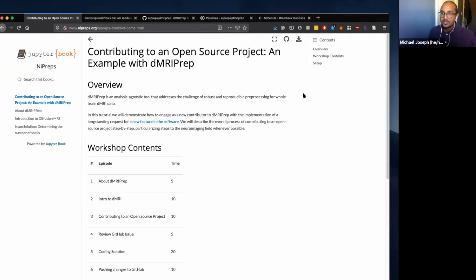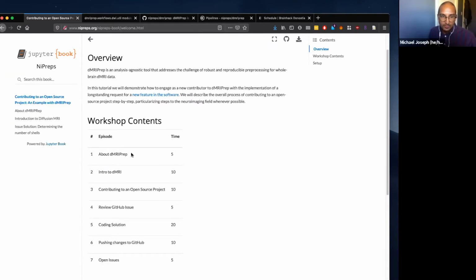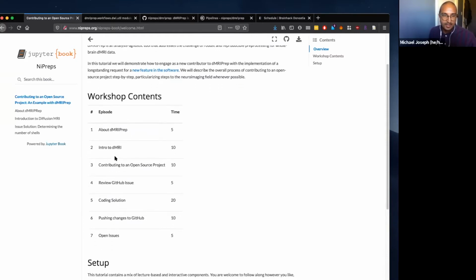With this tutorial, I'll go over how you, as a potential new contributor, can engage with the dMRIprep tools, dMRIprep in particular. We'd really like to continue building up the community around these tools. I'll start by giving an overview of dMRIprep, and I'll introduce you to some basic diffusion MRI concepts.